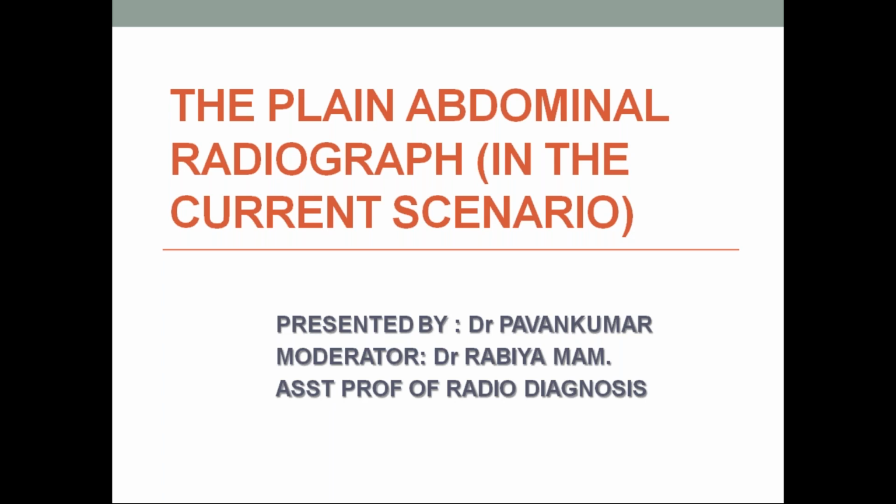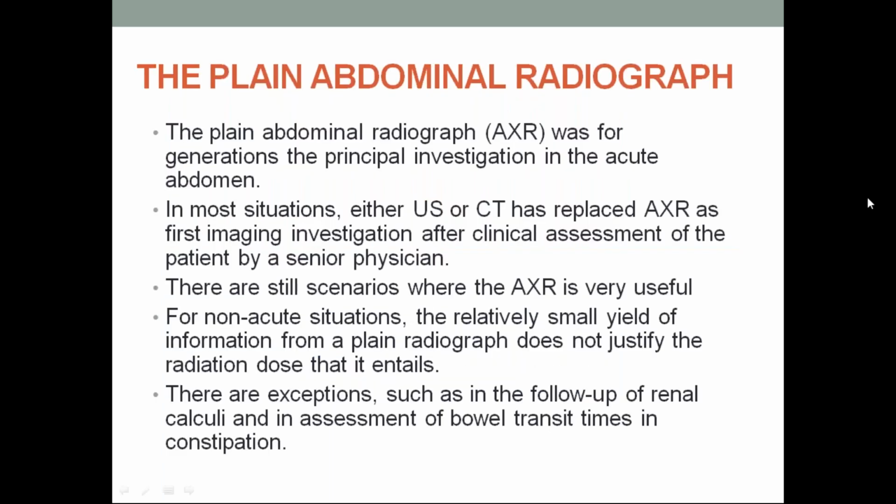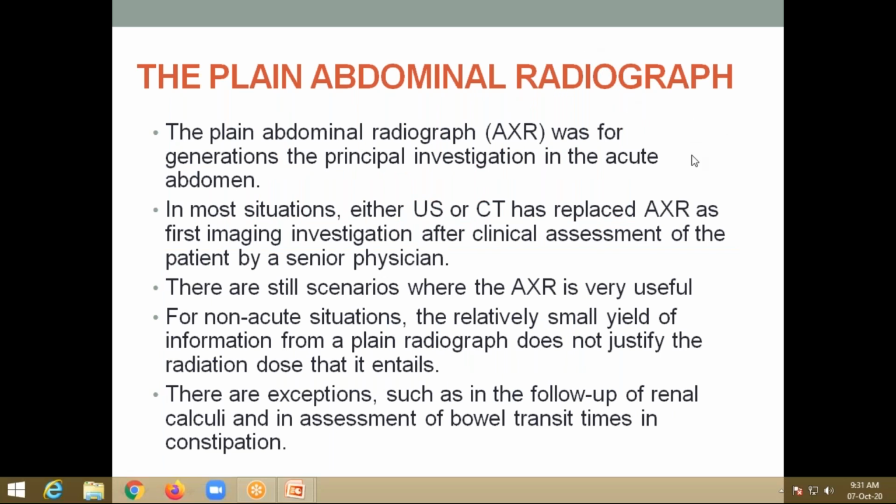Coming to the plain abdominal radiograph, this is very important. If you go to the internship, I will discuss a little bit about the basic principles, at what conditions we have to take the plain abdominal radiograph, what we have to look at in it, what the normal anatomy is, and what review areas we have to check. Okay, am I audible?